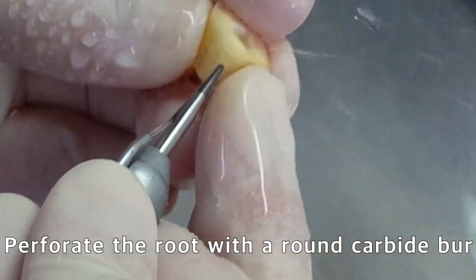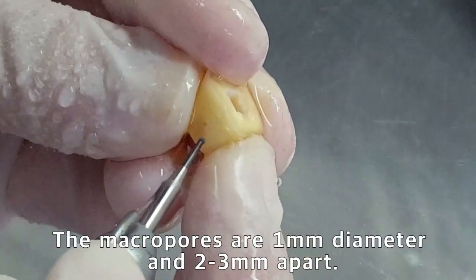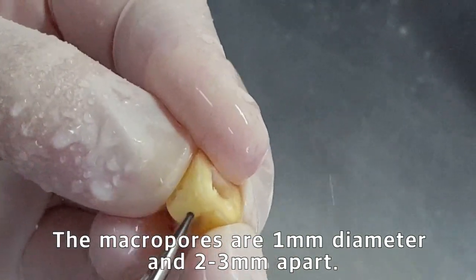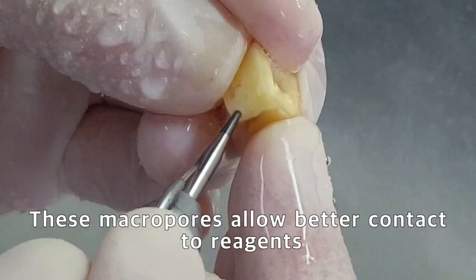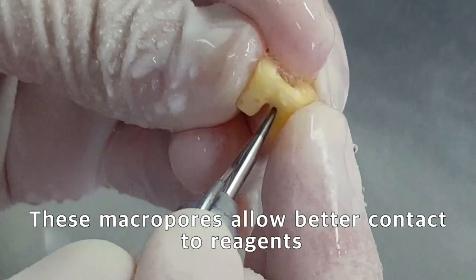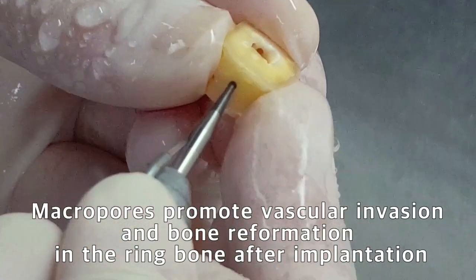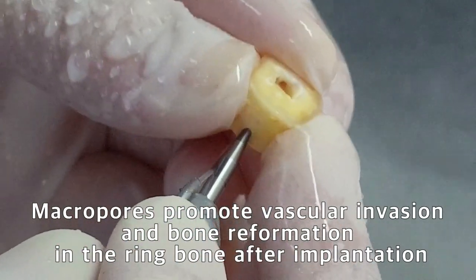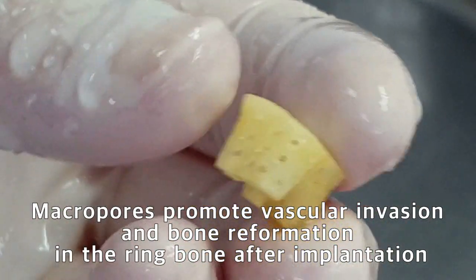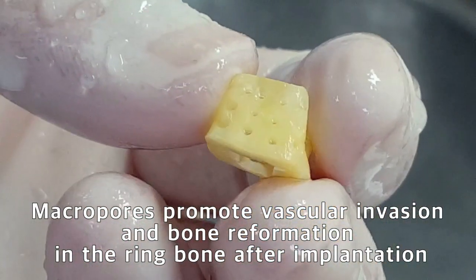Perforate the root with a small round carbide bur. A 1-millimeter diameter macropore is formed at intervals of 2 to 3 millimeters. These macropores increase the contact between the root and the reagent. After tooth ring bone is implanted on the bony defect, macropores promote vascular invasion and accelerate new bone formation in the implanted tooth ring bone.